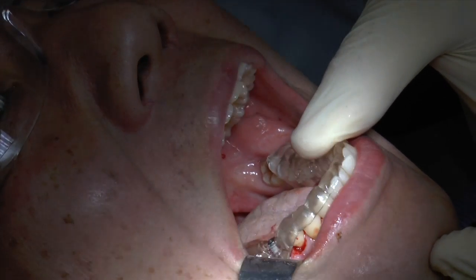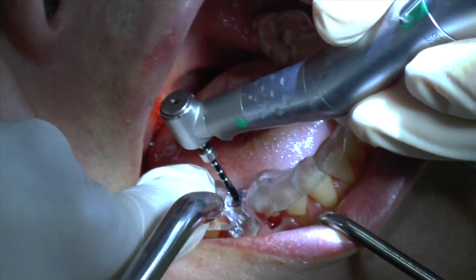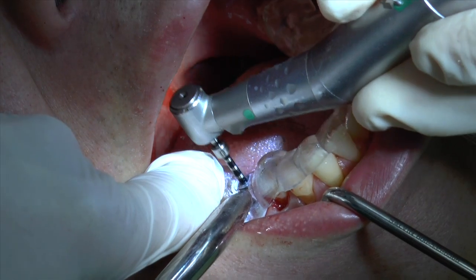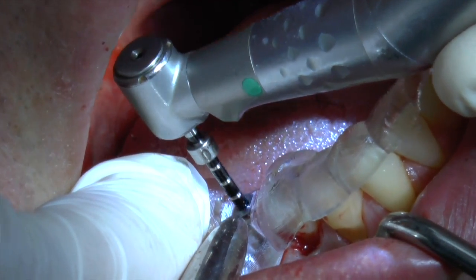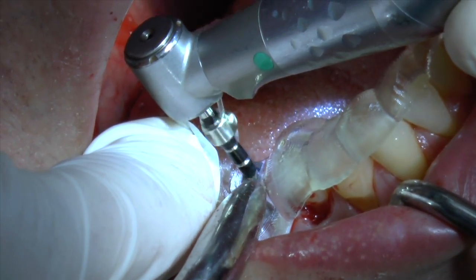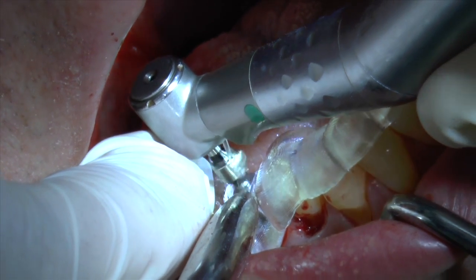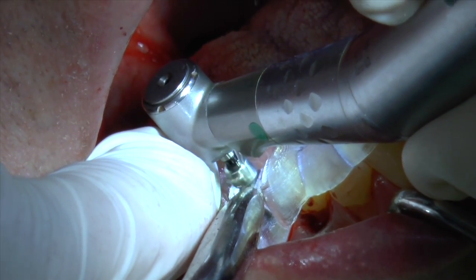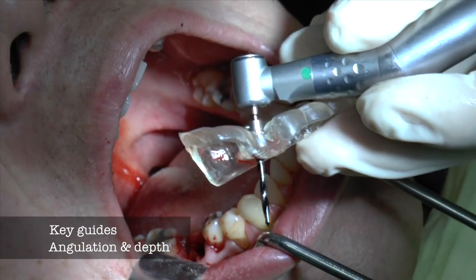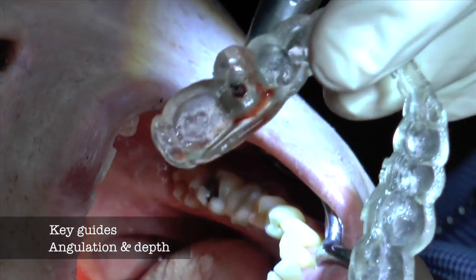It's important to get really great models when you do the scan from the start. We see that it's fitting down; our fingers are actually going to hold it down when we're doing the drilling. As I put this drill in, you can see I have the depth gauge marked — this is 10mm longer than an actual drill for a standard setup, so you can see how much I'm going to be preparing into the bone. Now part of this will be above the apex, because we're actually drilling into the furcation area, so we do want to have a good solid 3mm of bone below the apex area if we can. Sometimes we have to grab into the walls of the bone as we're going down through the furcation, and you can see this is showing the angulation and the depth.